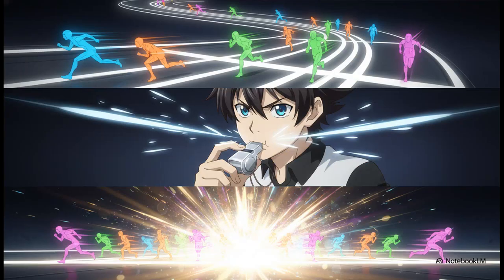Think of this 180-degree refocusing pulse like a massive foot race. You fire a starting pistol, and the fast runners sprint ahead, while the slow runners trail behind. They are completely out of sync. But suddenly, you blow a whistle. That's your 180-degree pulse. And you tell everyone to instantly turn around and run back to the start line.